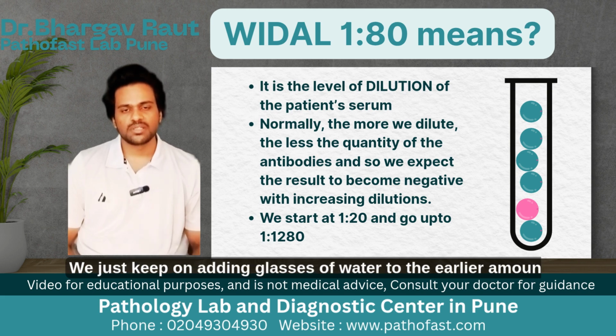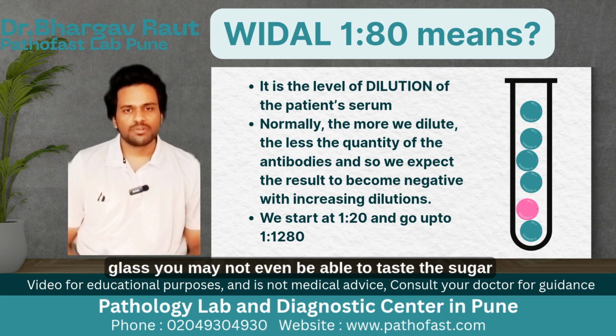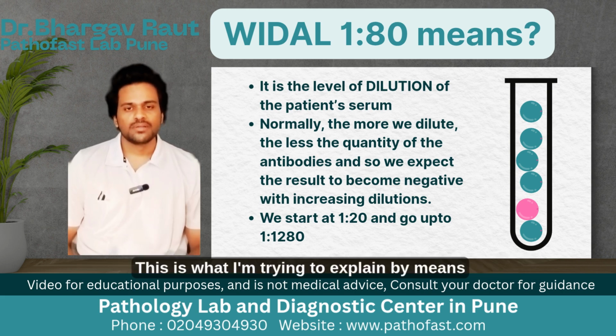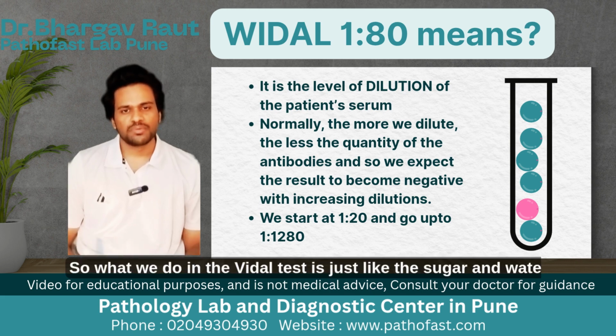Suppose we continue this, we just keep on adding glasses of water to the earlier amount of water that we already have. By the time you reach the 4th or the 5th or maybe the 6th glass, you may not even be able to taste the sugar anymore. This is what I'm trying to explain by means of a sequential dilution, which is what we do in the Widal test. So what we do in the Widal test is just like the sugar and water analogy.